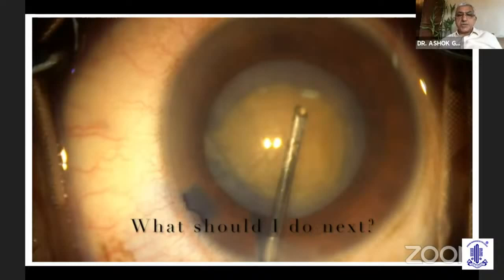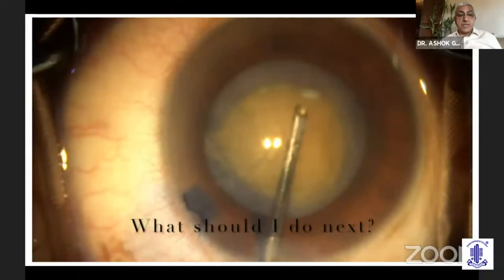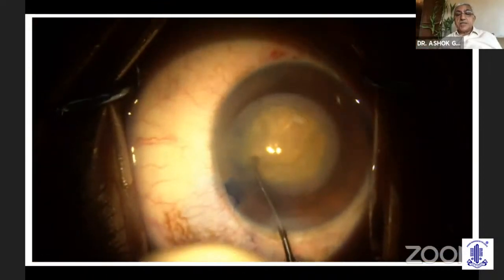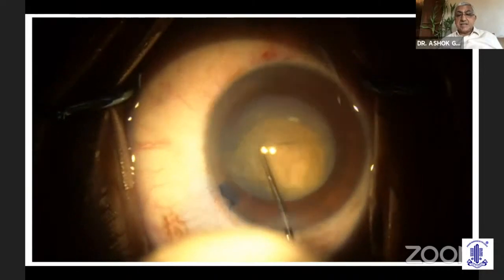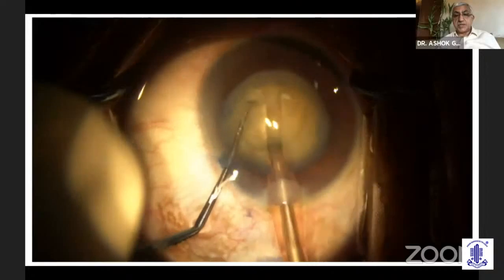And then I think of the options of doing a direct chop or doing a stop and chop. And then I decide that I would do a stop and chop and keep the forces of breaking the nucleus away from the area of the break. So I begin with a little rotation to check that there is good stability of the nucleus, and I decide to go ahead with the phacoemulsification by stop and chop technique.